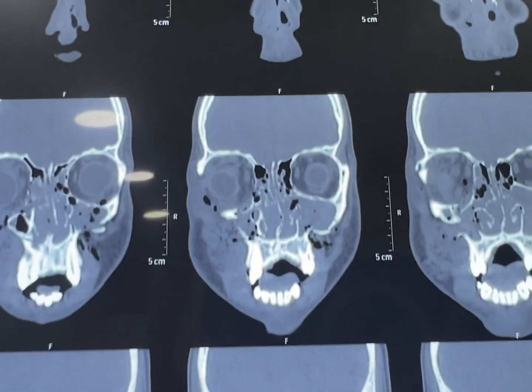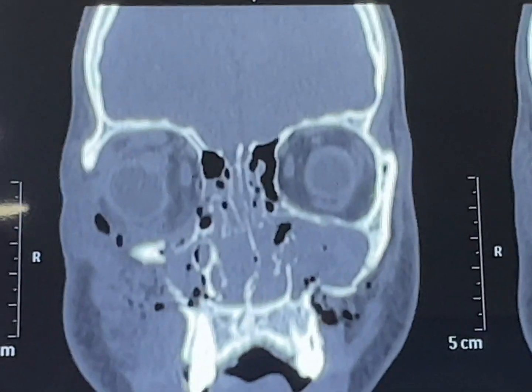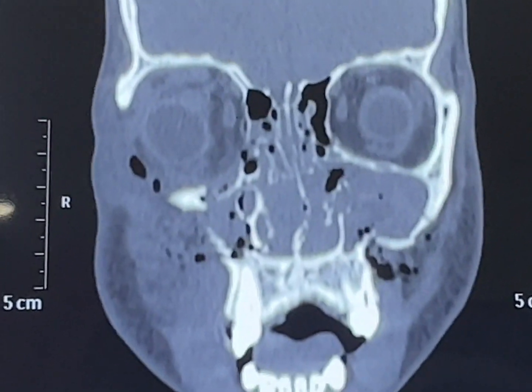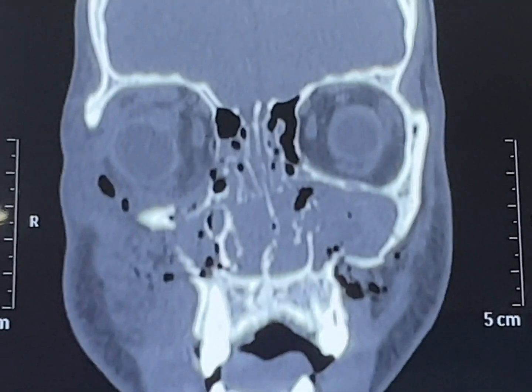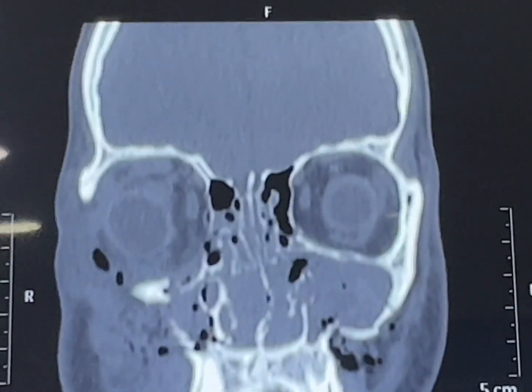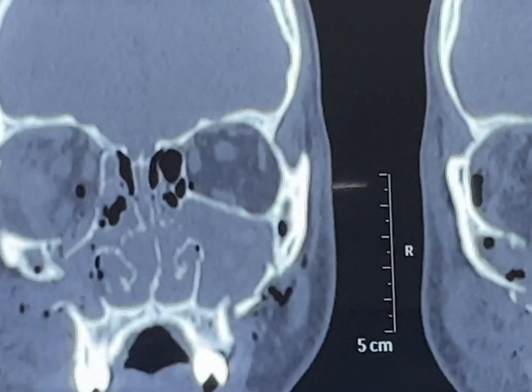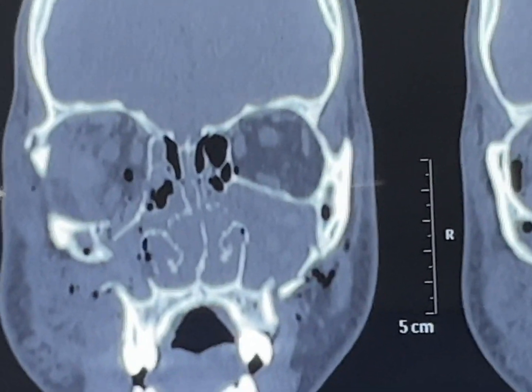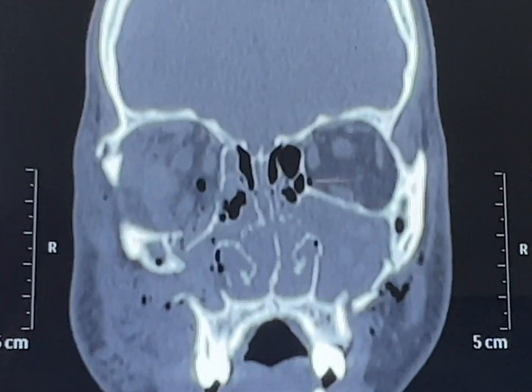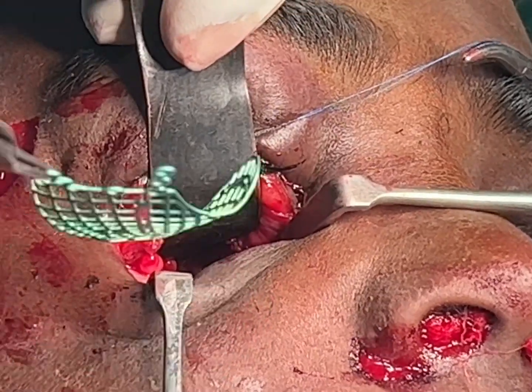This view clearly shows the size of the orbit, which is increased significantly because of fractures in the orbit and the fat has descended. We are going to reconstruct that — we're doing our orbital floor reconstruction here. This is a post-traumatic injury.